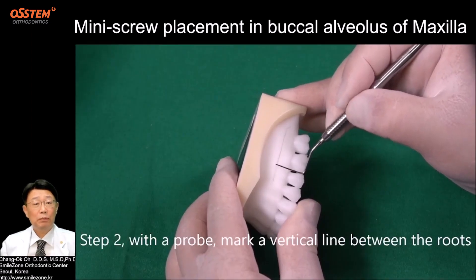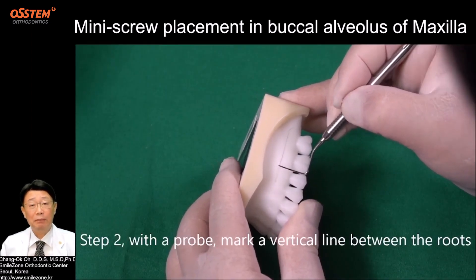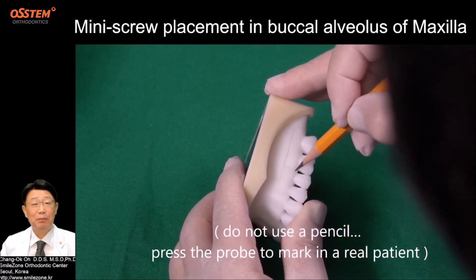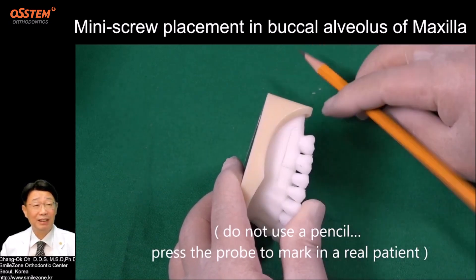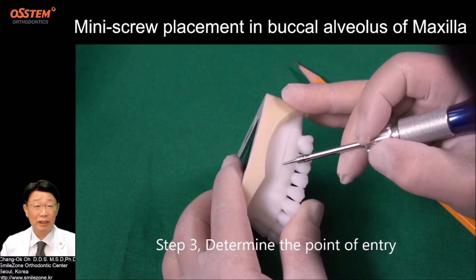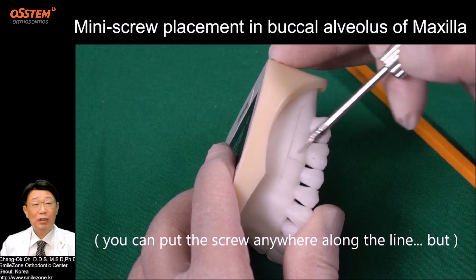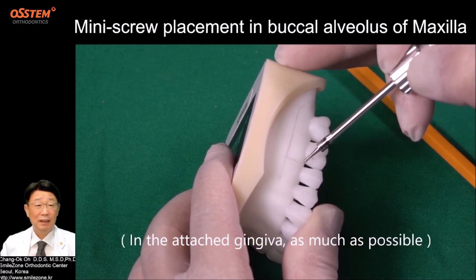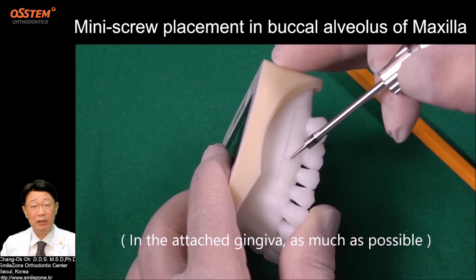Step 2: With a probe, mark a vertical line between the roots. Do not use a pencil — press the probe to mark in a real patient. Step 3: Determine the point of entry. You can put the screw anywhere along the line, but in the attached gingiva as much as possible.